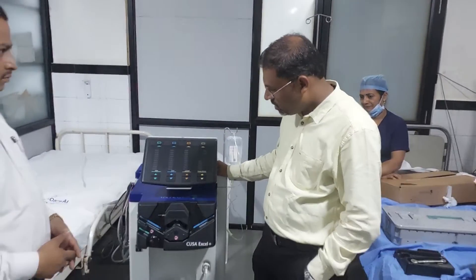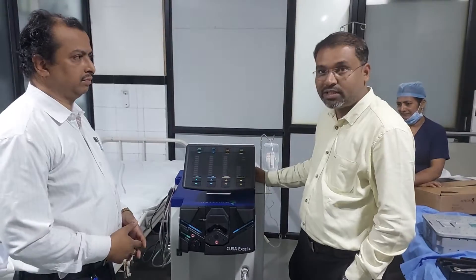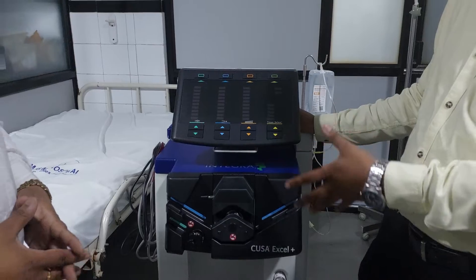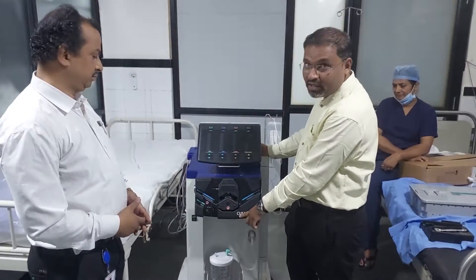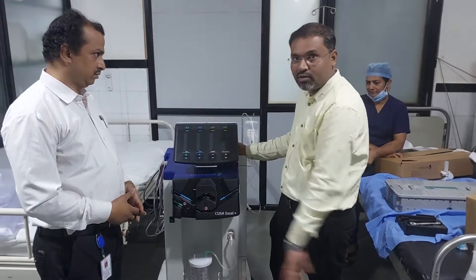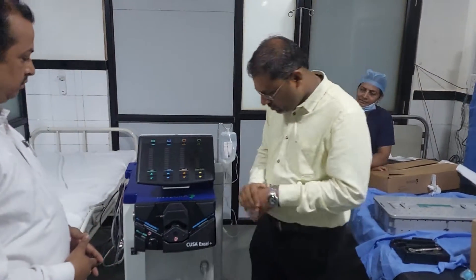Hello guys. Today we are going to learn how to make the basic arrangements of the CUSA XL Plus machine. Before surgery, what type of precautions we have to take and how to make the necessary arrangements before starting the surgery. CUSA stands for Cavitron Ultrasonic Surgical Aspirator. Before starting the machine, we have to learn the basic arrangements one by one.